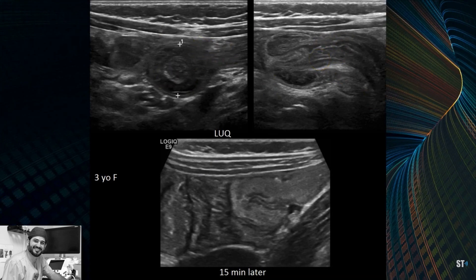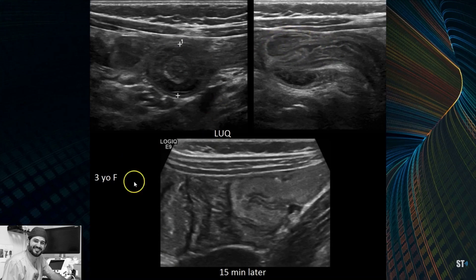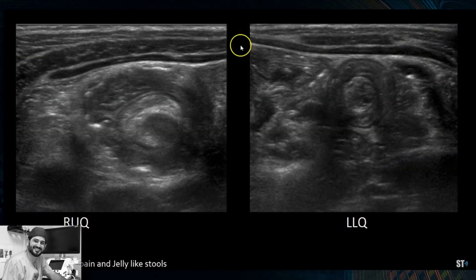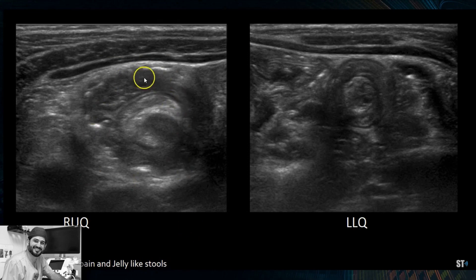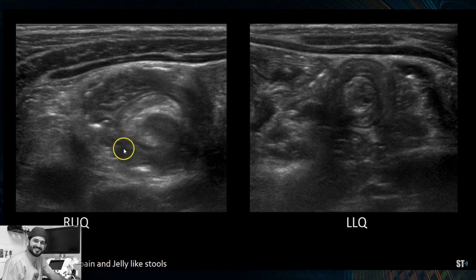Here's another case: a three-year-old female with a lesion in the left upper quadrant near the spleen — a small target-like lesion. Remember, ileocolic intussusception is in the right lower abdomen. In sagittal you can see it folding into itself, and 15 minutes later it was gone. That patient was asymptomatic. Then there's another patient — two years old — with abdominal pain, intermittent crying, and jelly-like stools. They had a large target-like lesion in the right upper quadrant and incidentally also a small bowel intussusception in the left lower quadrant, about two-thirds the size of the ileocolic.